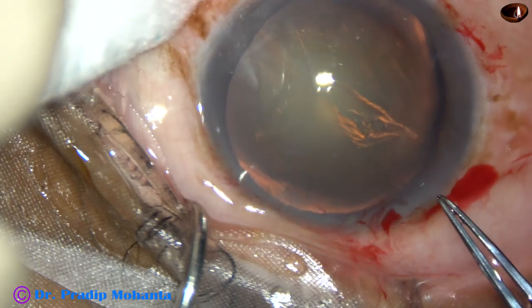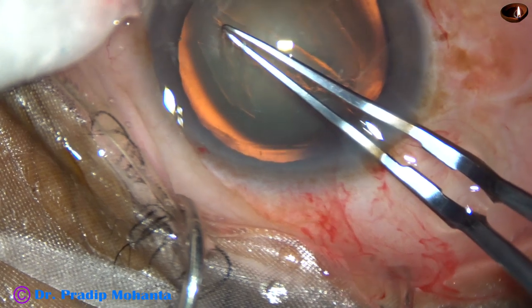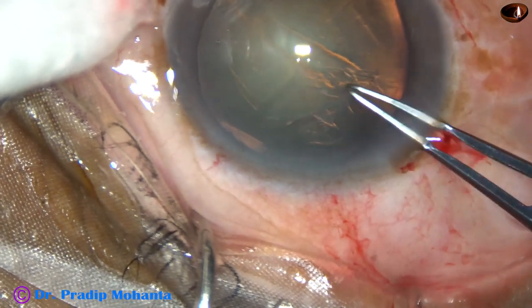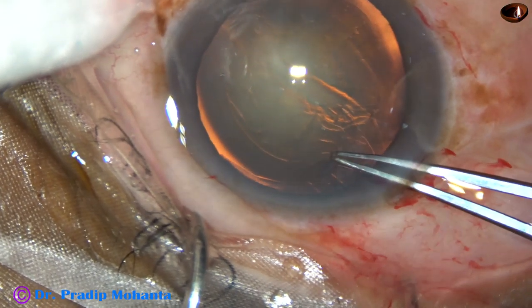Here go the rhexis forceps. Hold the capsular tag. The zonule in this area is OK. This patient has a history of trauma.